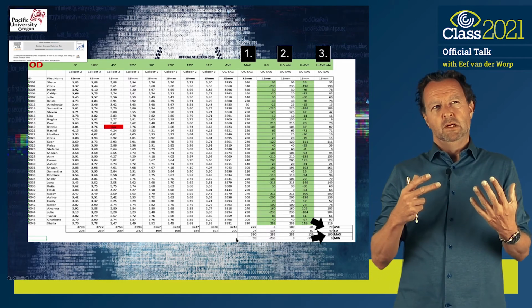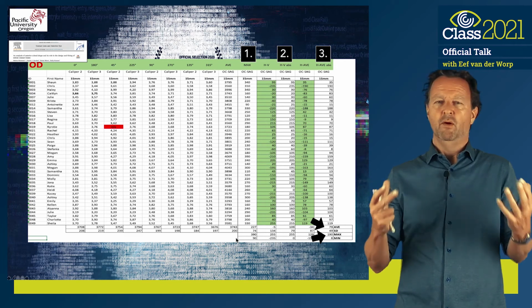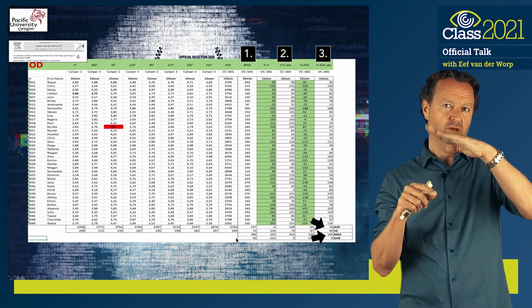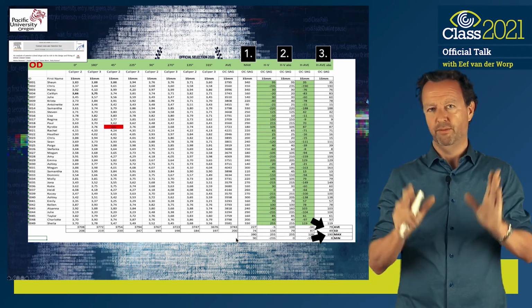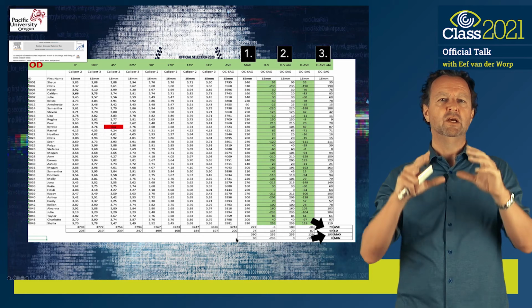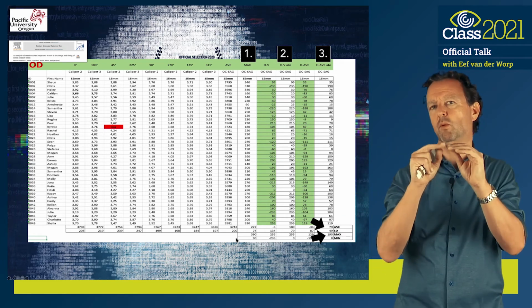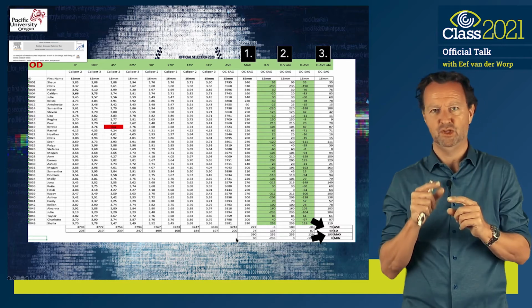So what am I actually trying to say here? What I'm trying to say here is that, okay, if you have an instrument that can measure different meridians all the way around, perfect, use that. Because the lens is going to flex different in different meridians, and you probably want to go by the average from everything that you have.